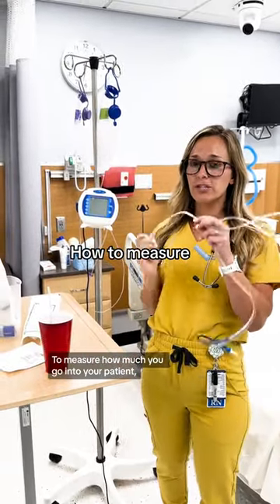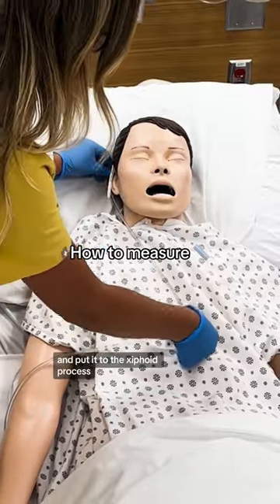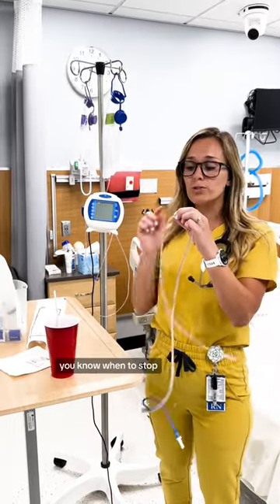Measure how much should go into your patient. Put the tube at the tip of your patient's nose to the top of their ear and then to the xiphoid process. This is how much you know to insert into your patient's nose. You can mark this with a piece of tape so that when you're inserting it, you know when to stop.